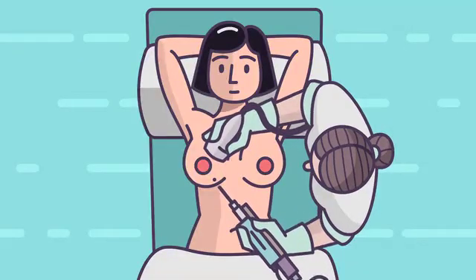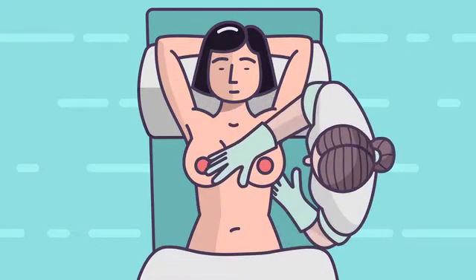Once the biopsy is complete, the needle is withdrawn, the site is compressed for a few minutes, and the small cut in the skin is covered with paper stitches and a dressing.